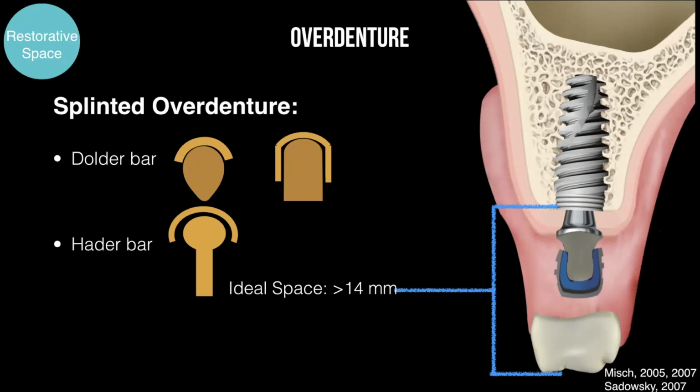And if you're giving the patient an immediate denture, make sure it's totally released, because studies show immediate loading on an overdenture is not a good idea. They have the highest amount of failure. Again, a CT scan can help in these cases, but sometimes for immediate we don't do it, because you already see the big socket. I don't know if I answered your question, but for metal reinforcement, we usually like to have it at least for people with a history of denture breaking or who have more than 2 implants.